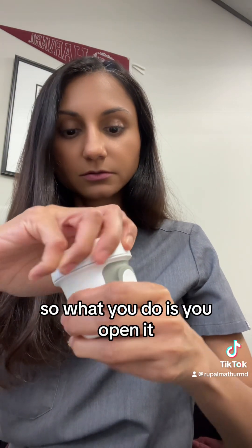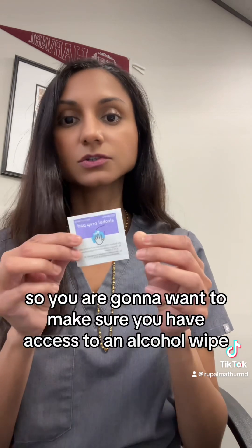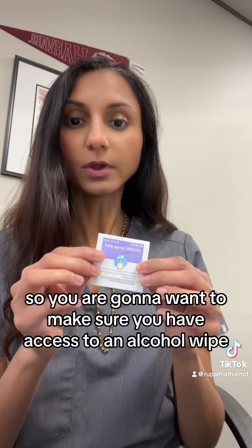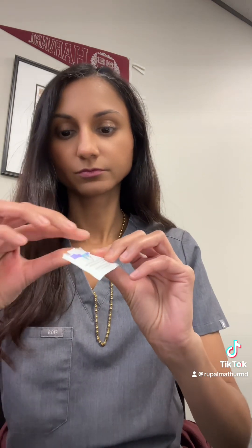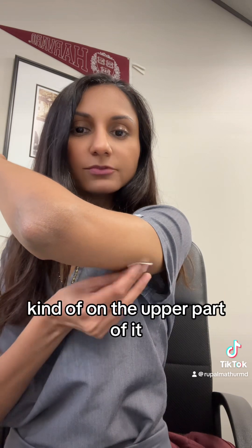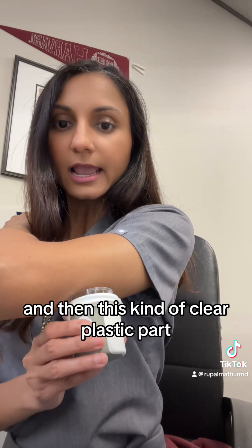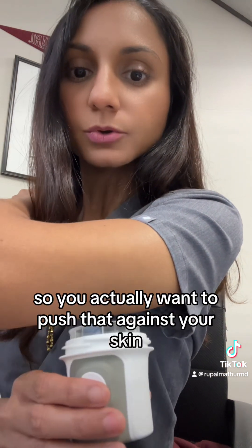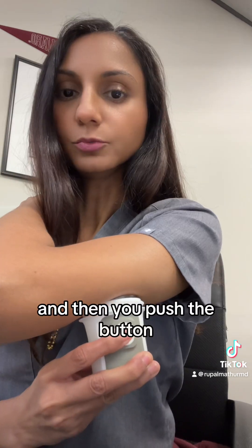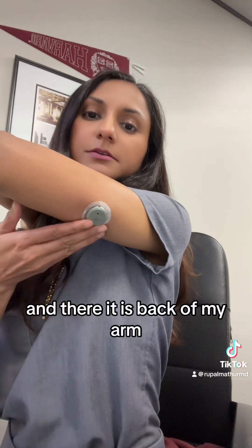So you open it. One thing to note is that it does not come with an alcohol wipe, so you're going to want to make sure you have one available before you attach your sensor. Go ahead and wipe the whole area on the back of the upper arm — right in the middle if you like — as long as you have enough subcutaneous tissue there. Then take the clear plastic part, push it against your skin, and push the button. There's a loud sound, but it did not hurt. And there it is in the back of my arm.